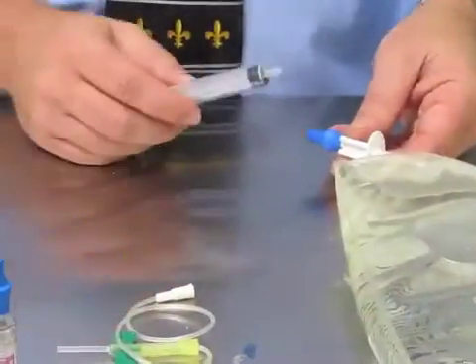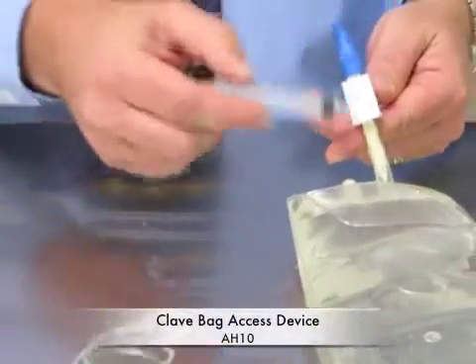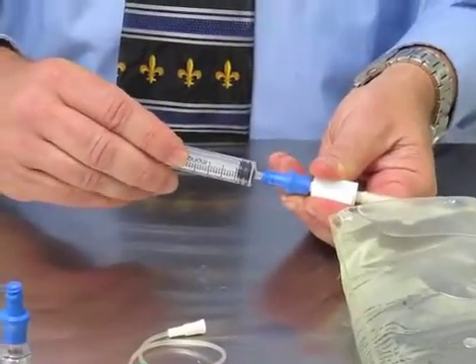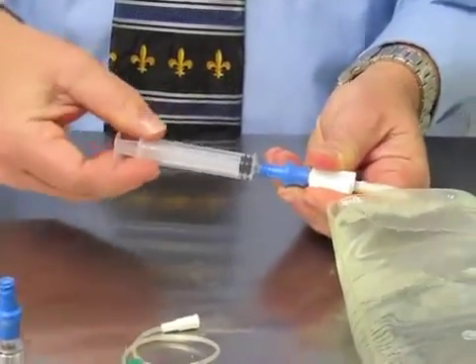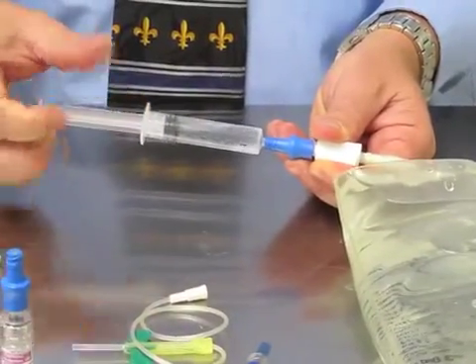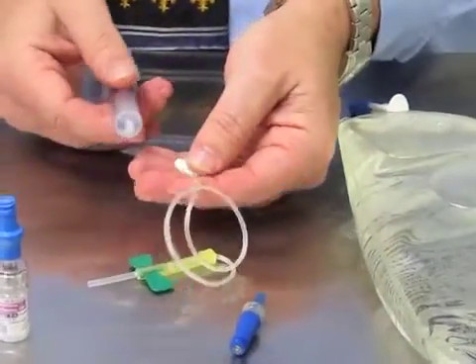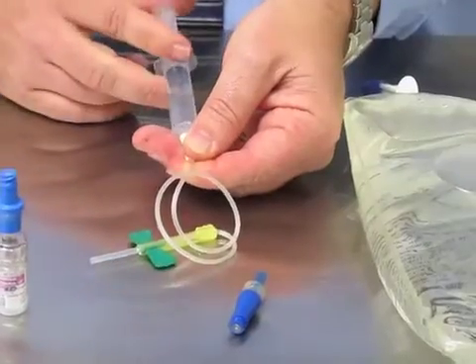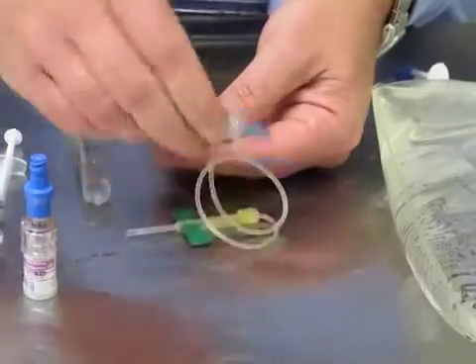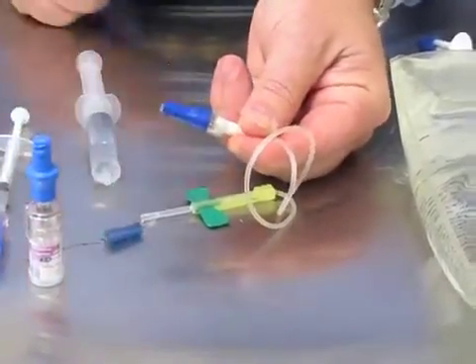My next step is to pull up a flush syringe so I can prime my winged set. The clave technology is on a bag access device — again, this is needle free. If you're using lure slip, I recommend when you go into the microclave that you do a quarter turn, which gives you a good secure connection. I'm going to drop my flush and prime my winged set, and I'm going to add a microclave to the winged set to keep it closed.